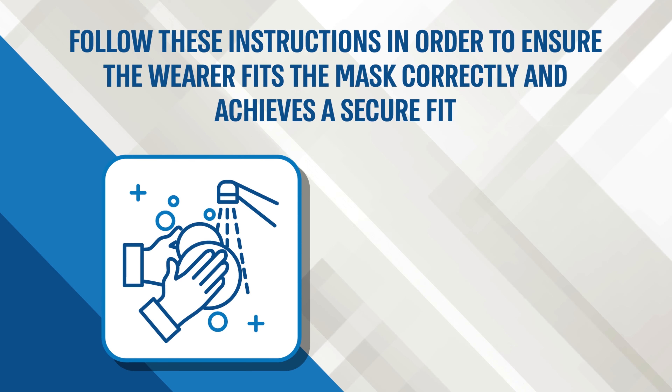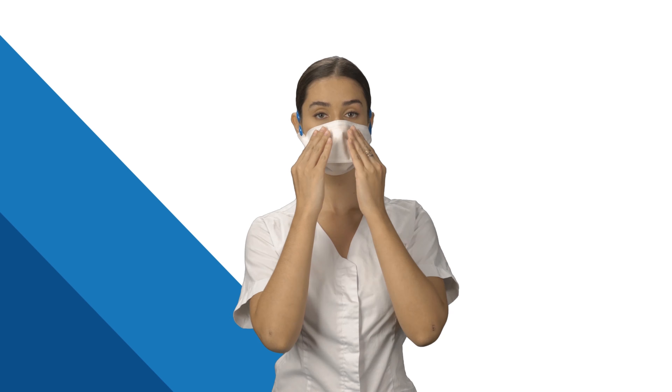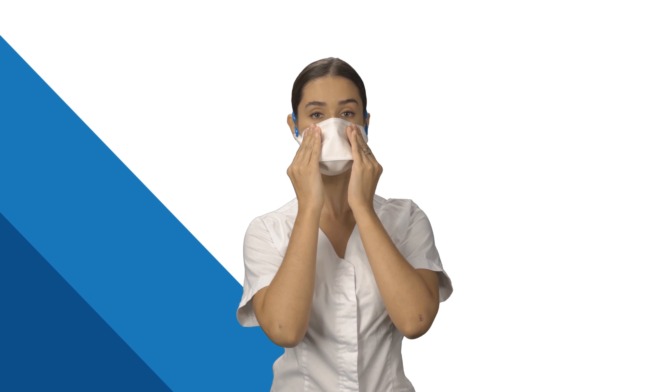With one hand, hold the mask on your chin and nose, while with the other hand, pull the two straps together around your head. Place one strap on your neck and the other strap on top of your head so that your ears are between both straps.